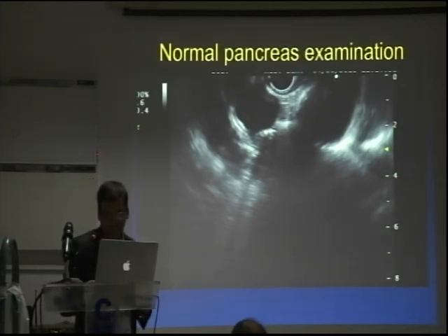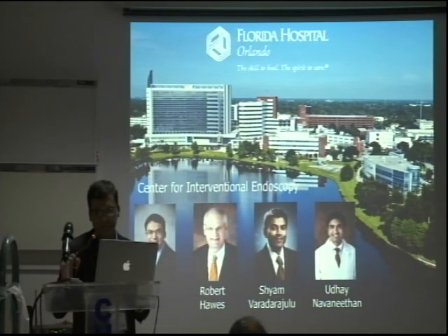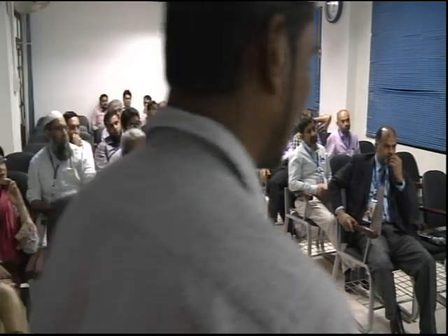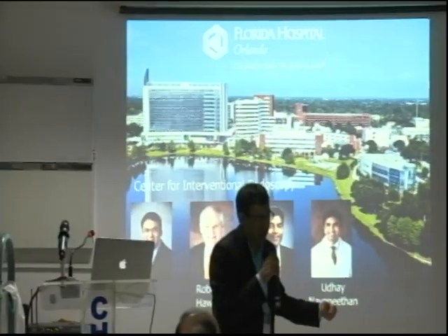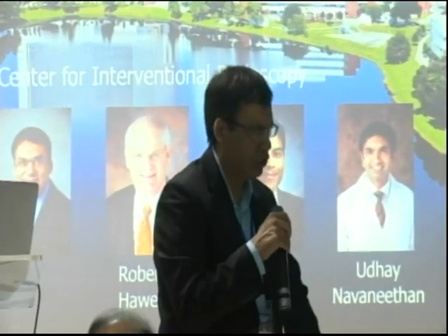Yes. Sir, when you talk about the clockwise and anti-clockwise motion, the movement should be from the shoulders, right, and from the hands? Yes, you can use both. It depends on what position you are in. Sometimes you have to use shoulders, other times you have to use the wrist. Like when you go extreme anti-clockwise, especially from the duodenal bulb, when I have to take a look at the right lobe of the liver, segment 5, I have to use my wrist. Shoulders won't work there.